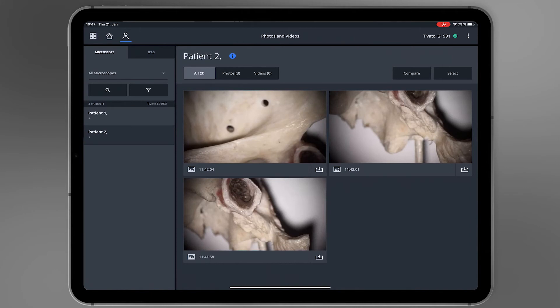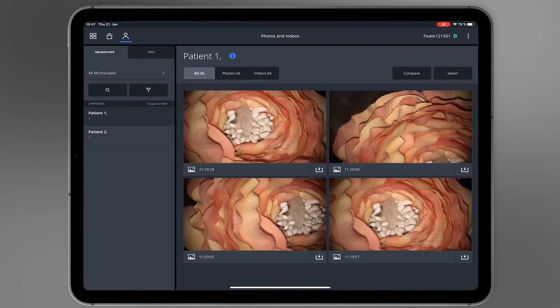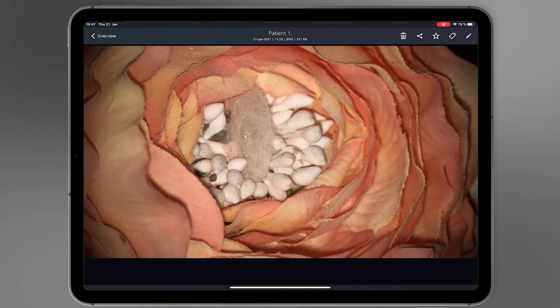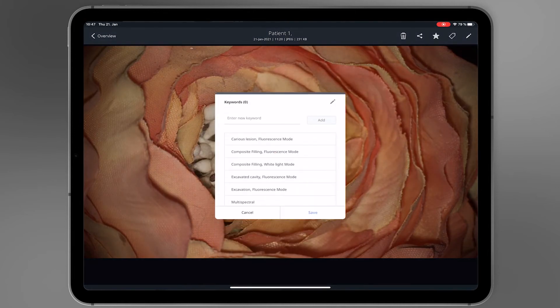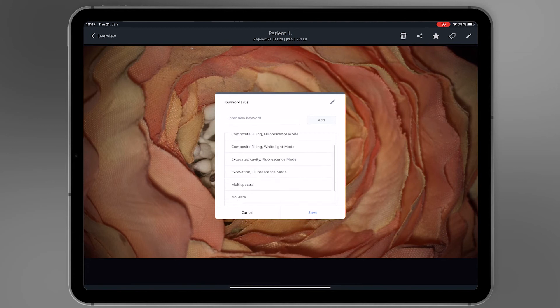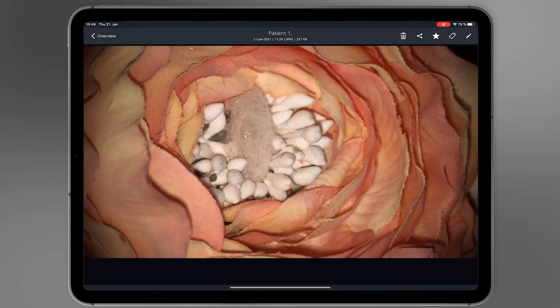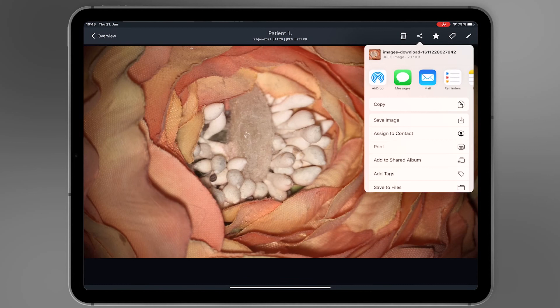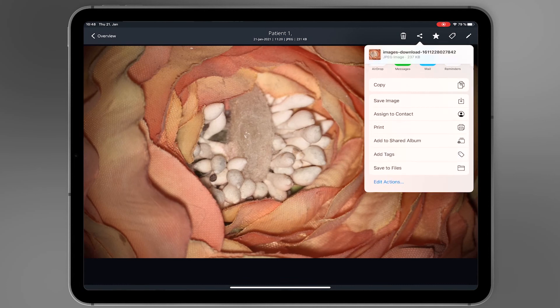Select a patient to see related photos and videos. Select a picture to mark it as favorite, annotate it, or to tag it. Save or share the picture via the integrated iPad sharing functionalities.